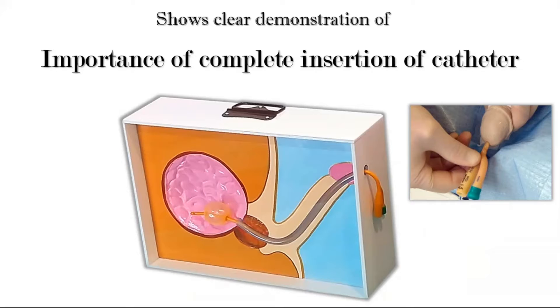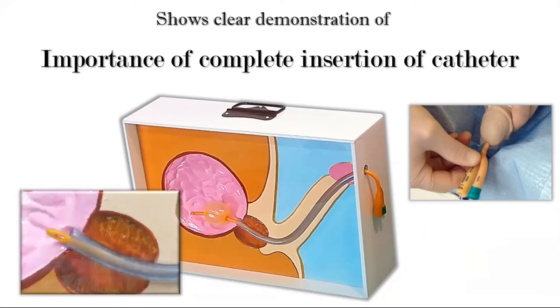Once students come to know about the location of the balloon, they will understand why it is important to introduce the catheter completely in the male urethra before inflation of the balloon. Unfortunately, many students carry a misconception that the balloon should be inflated as soon as urine starts flowing out of the catheter. But this model will show them how dangerous this mistake could be — they can clearly see that when the tip and eye of the catheter are inside the bladder, the balloon is still inside the urethra.